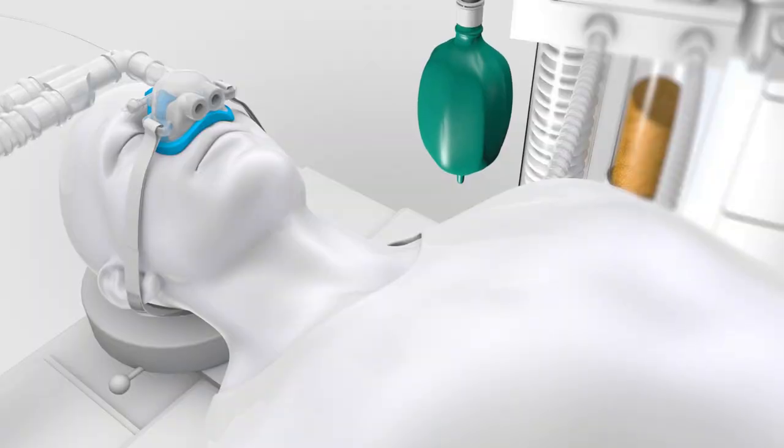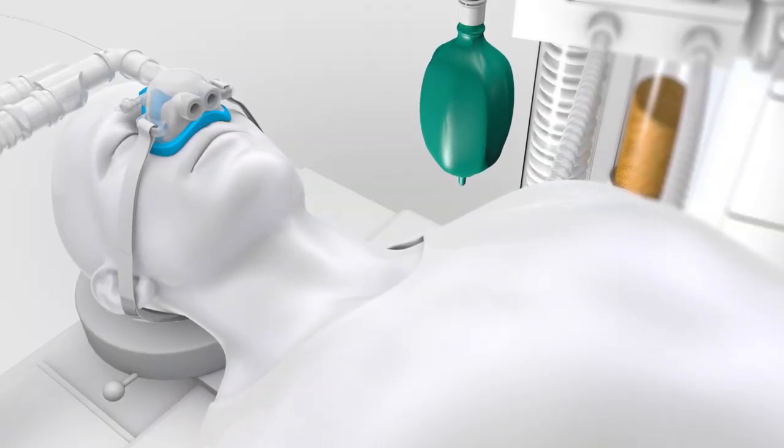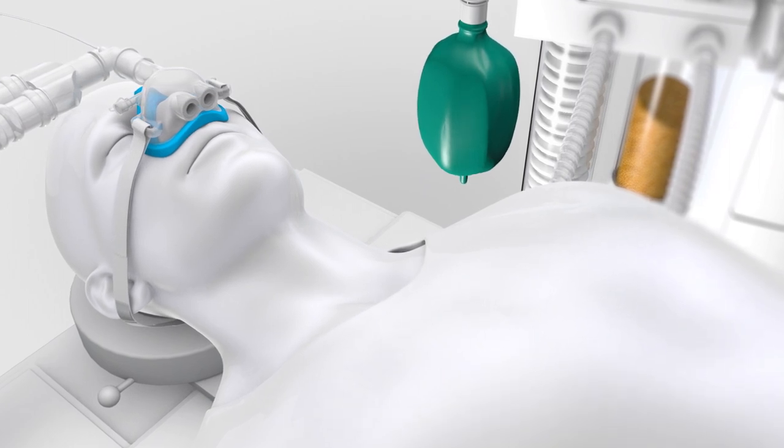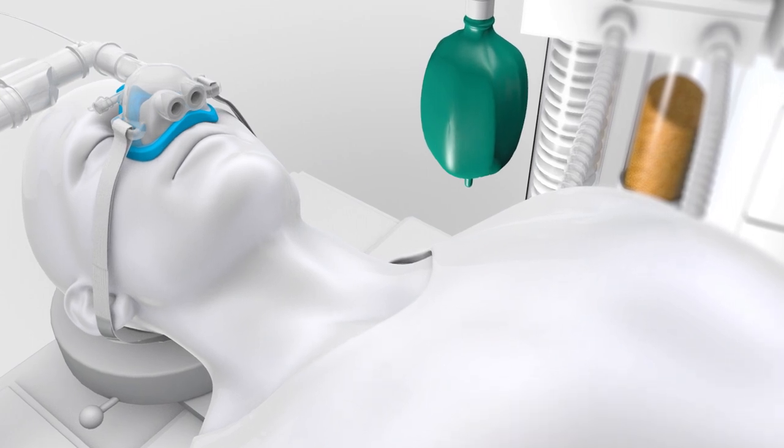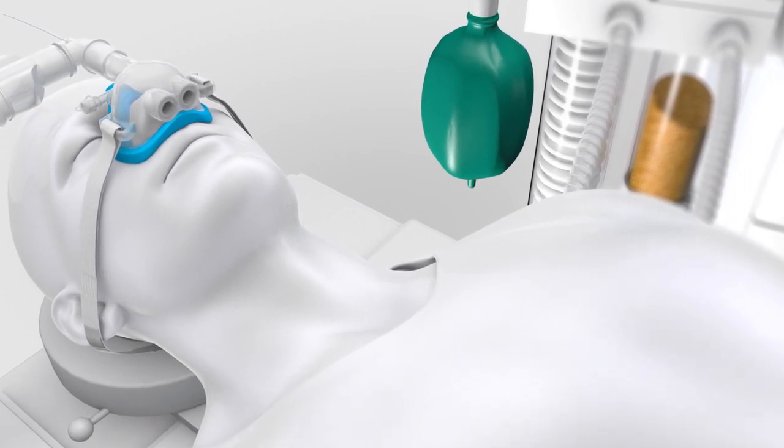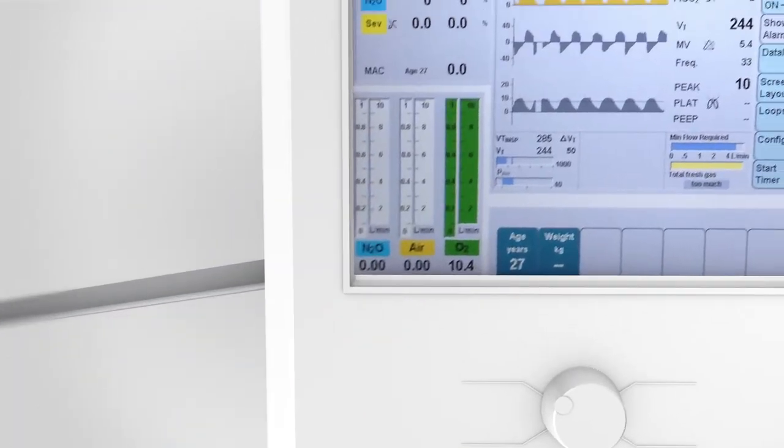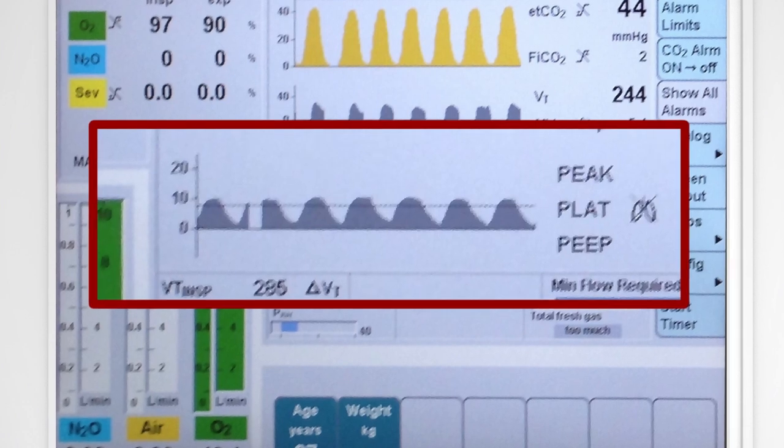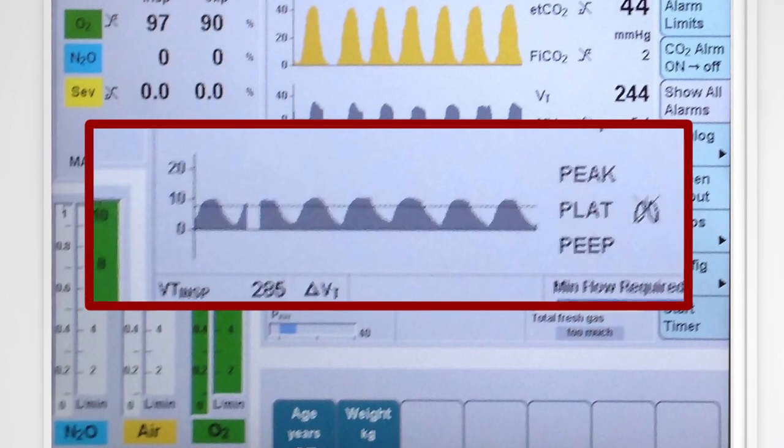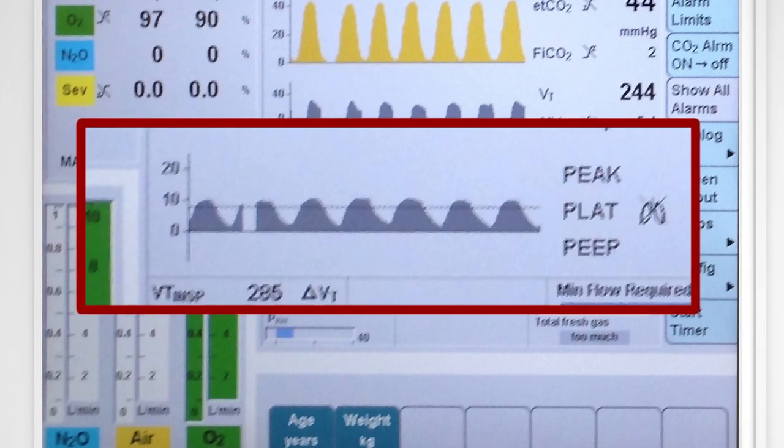With the SuperNova device properly sealed on the patient's face and fresh gas flows set at a rate higher than minute ventilation, the reservoir bag will fill and pressurize. Visual inspection of the reservoir bag will reveal intermittent deflation indicating successful patient inhalation. In addition, the pressure manometer and waveform on the ventilator's monitor will show intermittent decreases in pressure during spontaneous ventilation, another way of monitoring successful inhalation.